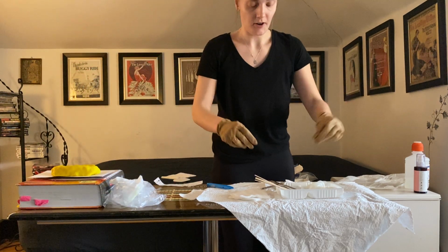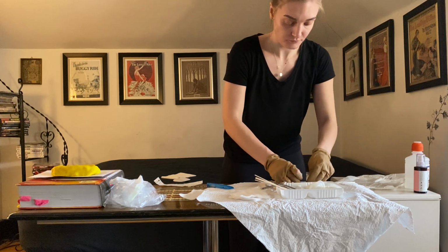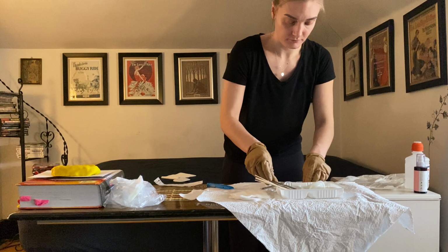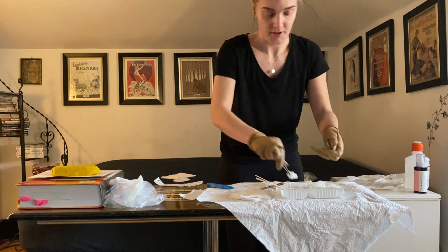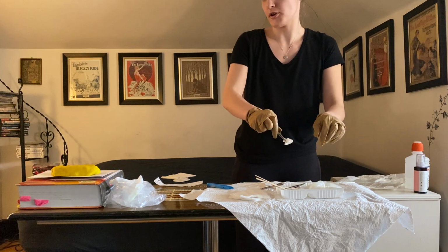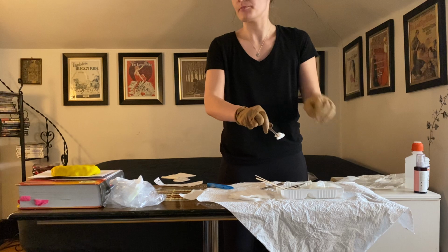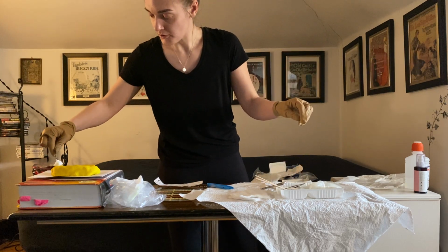And then I need to clean the peri wound as well. So just making some rosettes here. Dabbing that with the saline. And then I'm going from cleanest to dirtiest as well. So let's say the head's towards the farther side, 1 swipe per wipe.